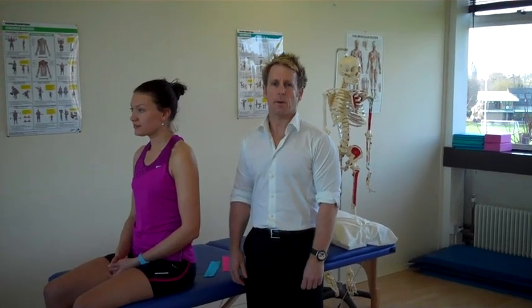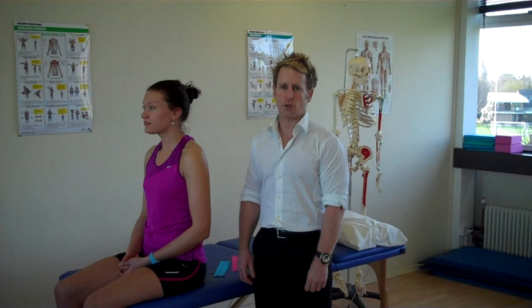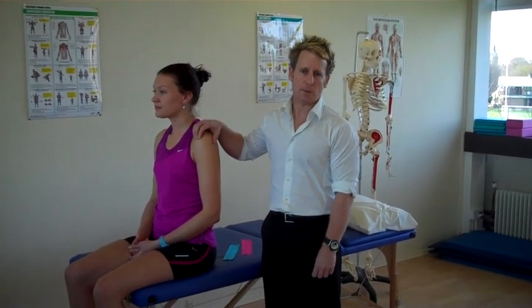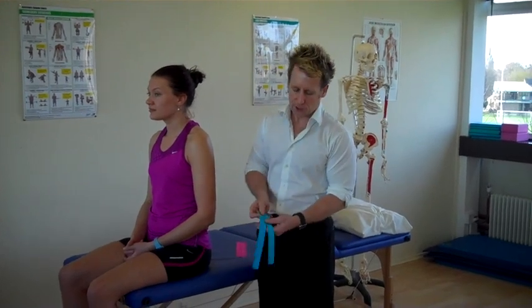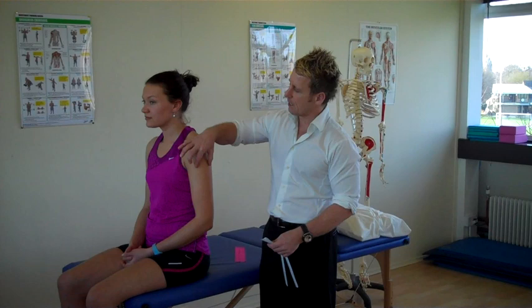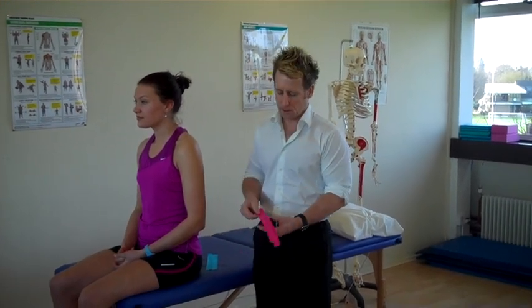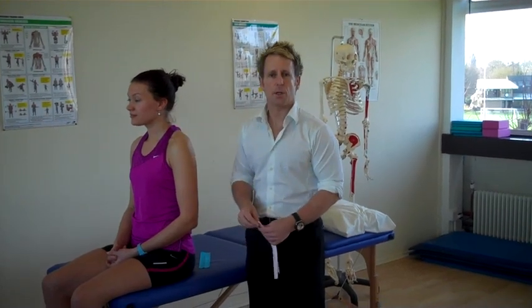Hi, my name is John Hibunders. I'm a sports osteopath and today I'm going to be using kinesiology taping — using functional tape — to stabilize a rotator cuff strain. The first application uses a pre-cut eye strip changed into a Y, to stabilize the deltoid muscle. The second strip, also a Y strip, is going to stabilize the supraspinatus.